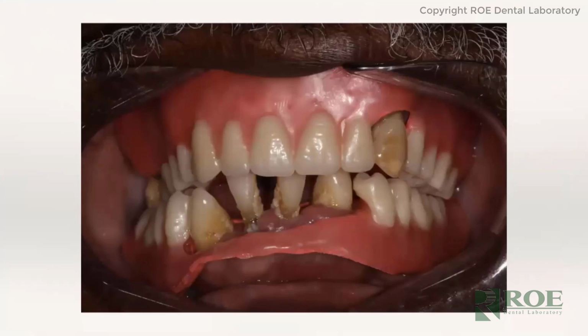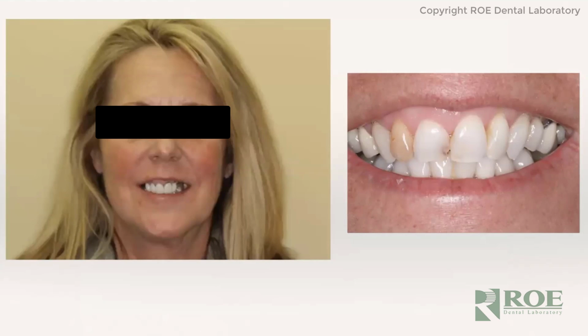We can also see in the anterior and the lower anterior that those teeth are very mobile. He would not let me remove any of them. That was the big problem. So that when those teeth are removed, he's all of a sudden going to collapse in a little bit more than what we have right now and reduce our vertical. All these things need to be taken into consideration, but the staff needs to understand what we're doing along the way. They can't just plan the patient's surgery, since we have extra appointments, which are necessary.